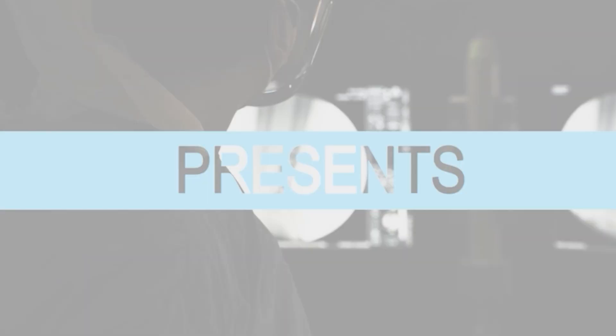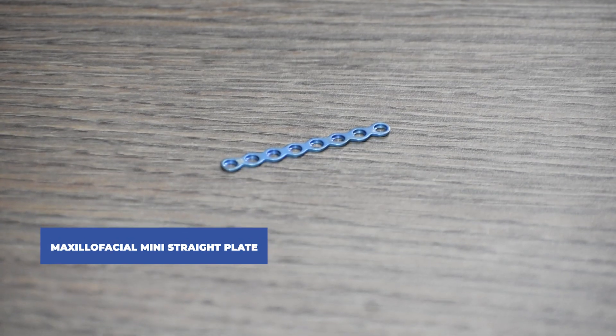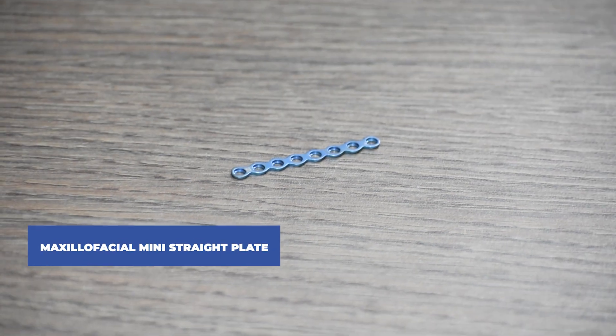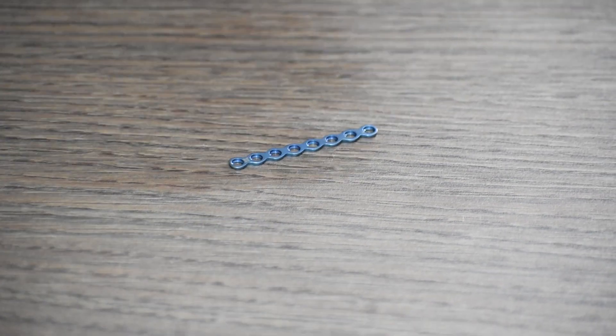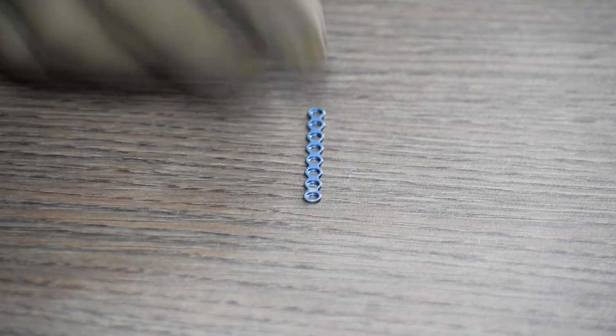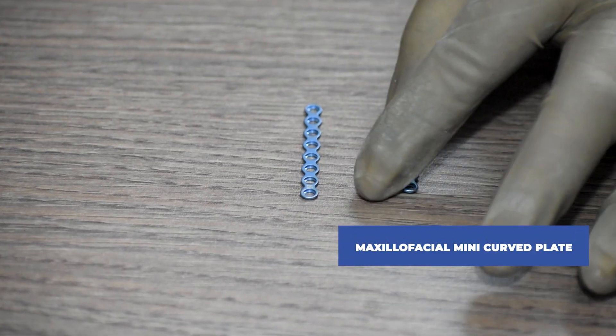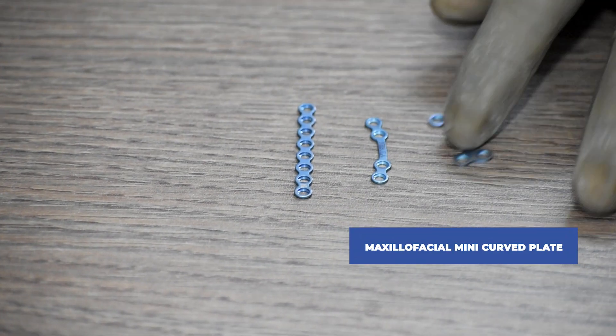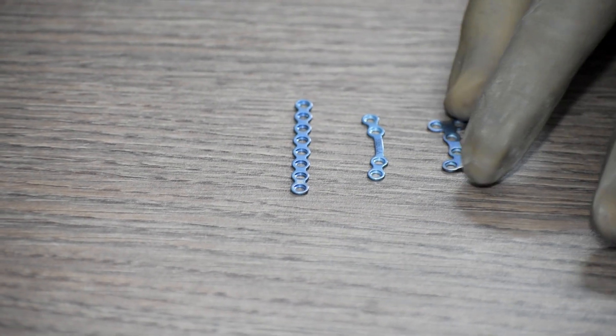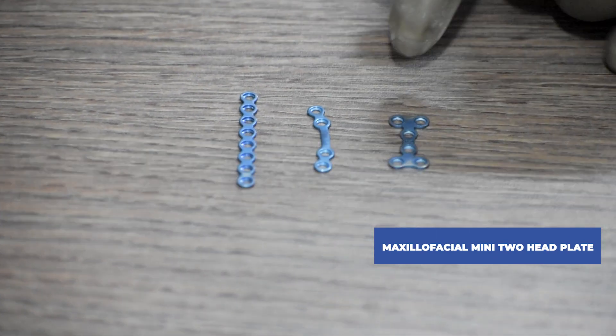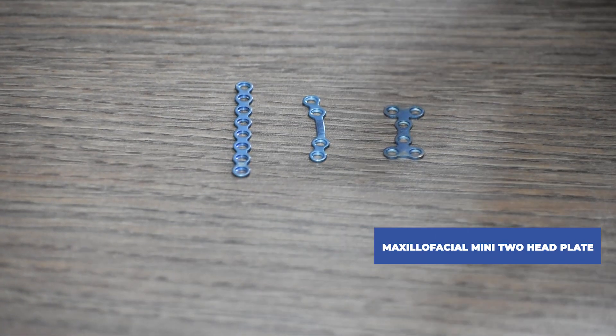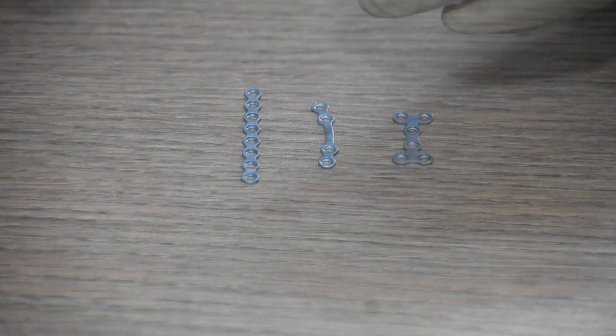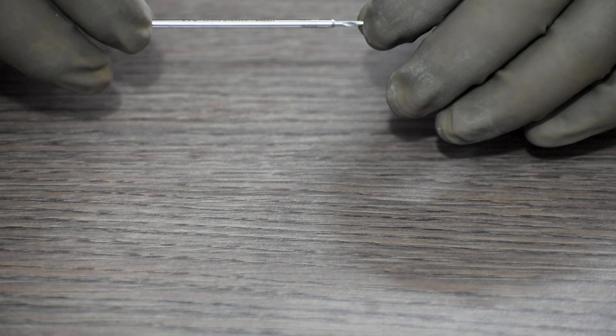We are going to discuss three types of maxillofacial mini plates. Number one, maxillofacial mini straight plate. Next, maxillofacial mini curved plate. And lastly, maxillofacial mini two-head plate. There is an option to insert two screws in each of the heads. That's why it is called a two-headed plate.